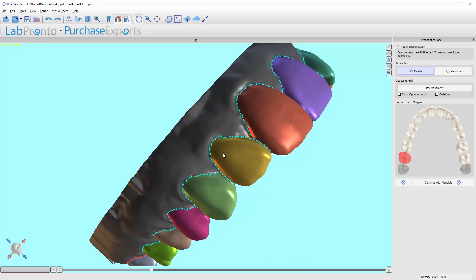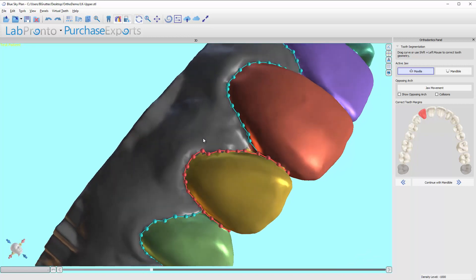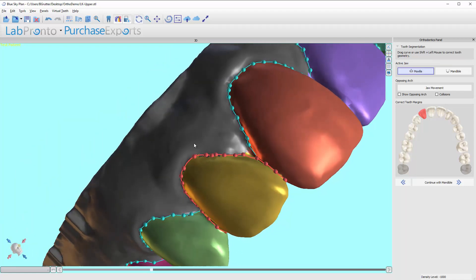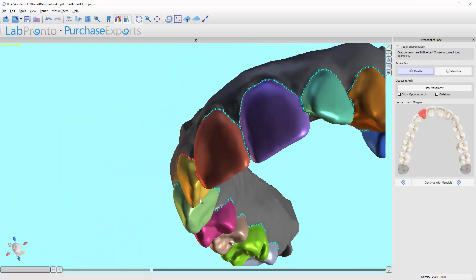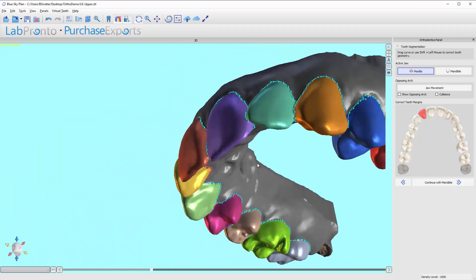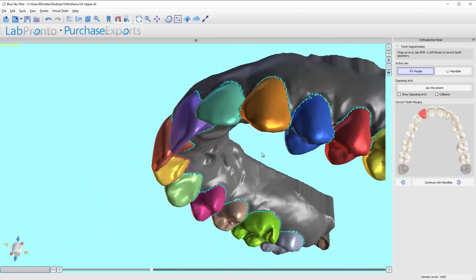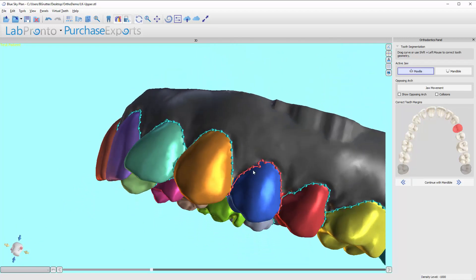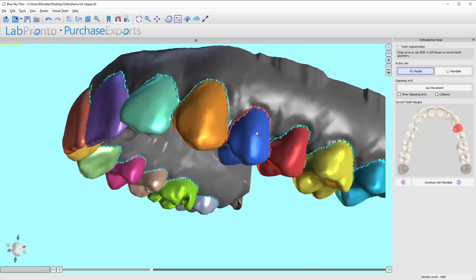Now if I click on this tooth, it turns red — it's ready to be edited. I'm going to hold Shift and draw the line. Notice it just redrew the line following where I drew it. Here's another little area — I'll click on this tooth to activate it. There, that's corrected.